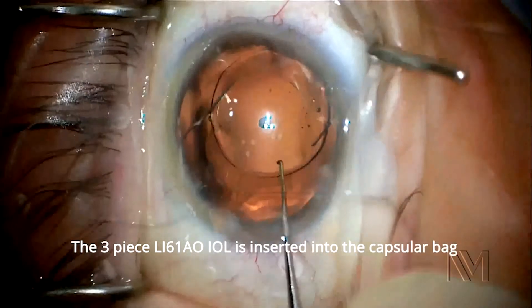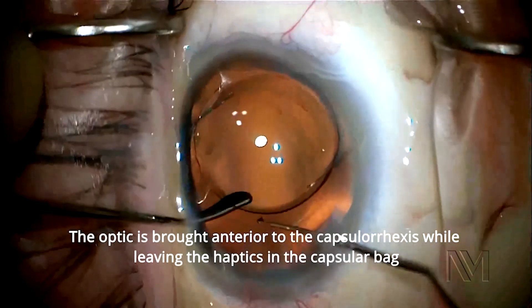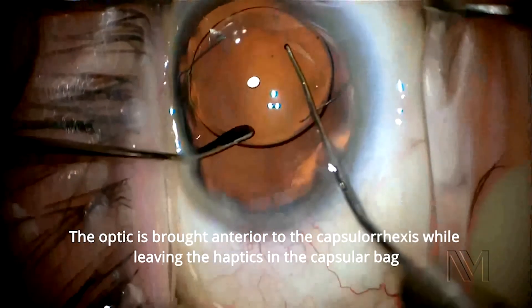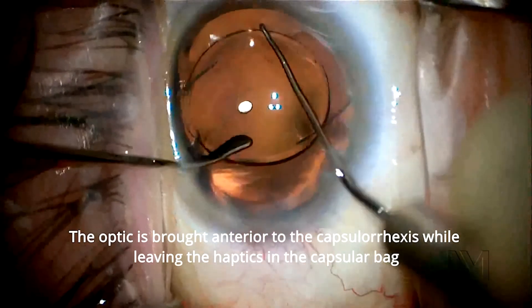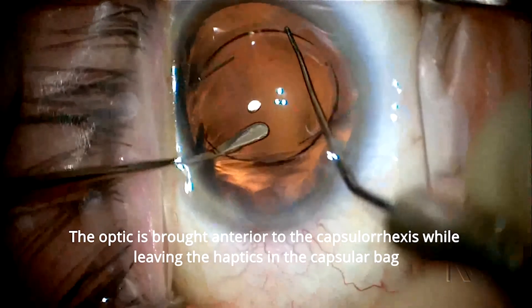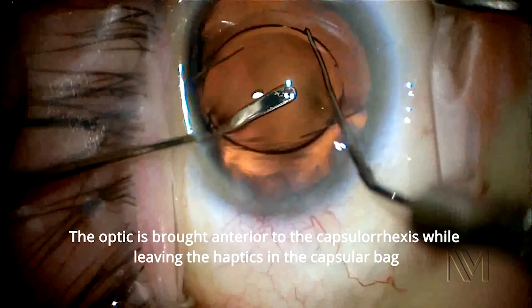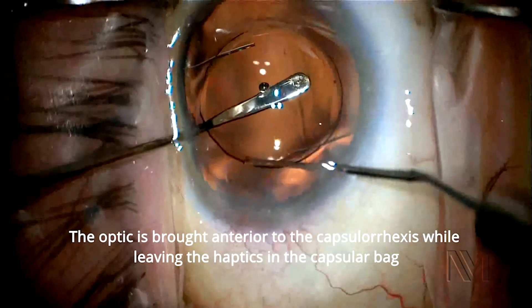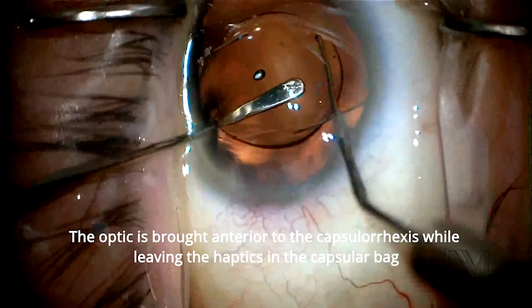A three-piece silicone intraocular lens was then dialed into the capsular bag, after which reverse optic capture was performed. This started by elevating the proximal edge of the optic in front of the edge of the capsular rhexis. The distal edge was then engaged with a Sinskey hook and prolapsed forward.